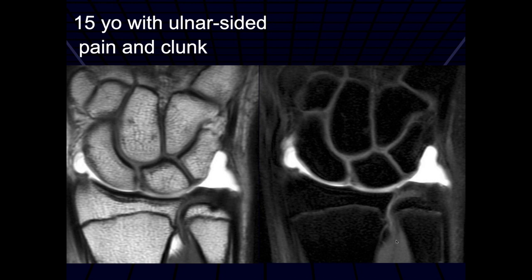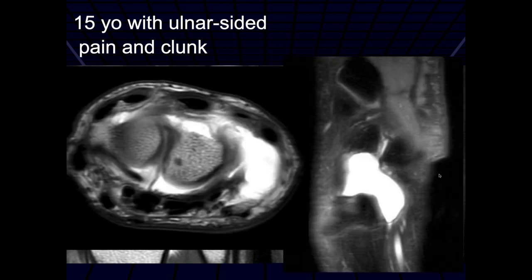At least the radial side of the TFC looks normal. There is a lot of fluid at that kind of pre-styloid recess, so I'm wondering if there's something abnormal going on there — it's extending out too much.